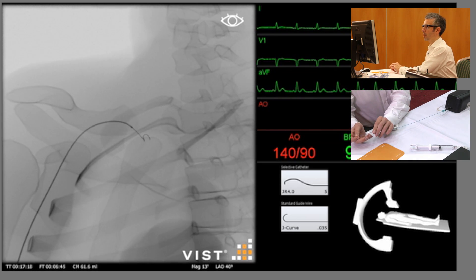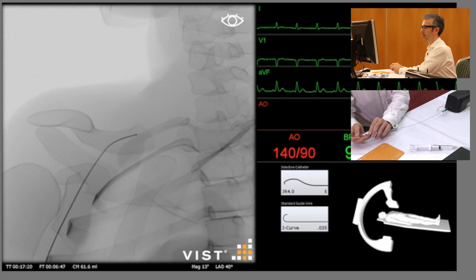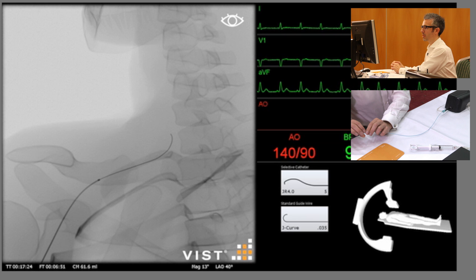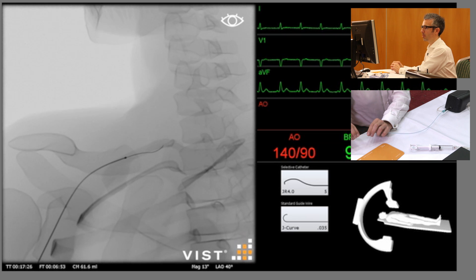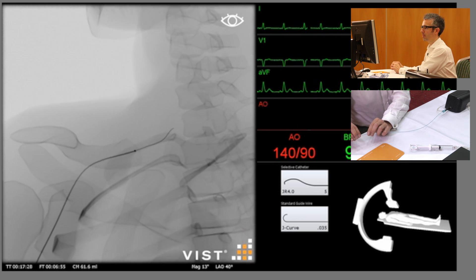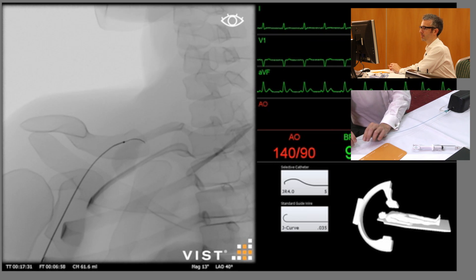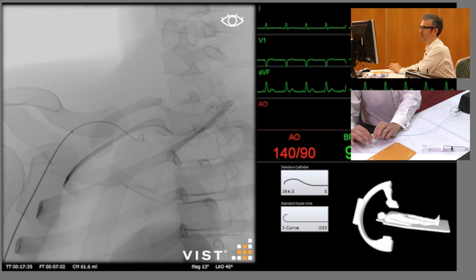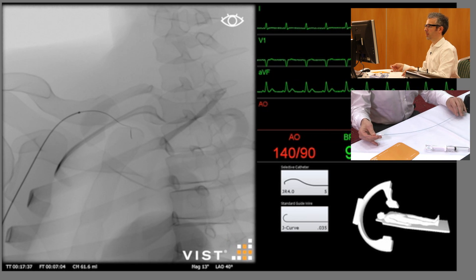We've got a little bit of resistance with our wire there so I'm just going to come back with the wire, try and redirect. That's heading towards the head and neck vessels. So again we bring the wire back, back a little bit further and redirect our wire. Quite a tortuous subclavian here by the looks of things.